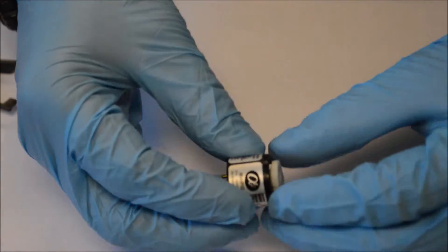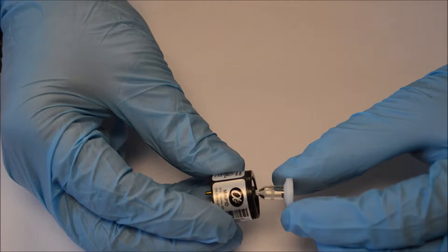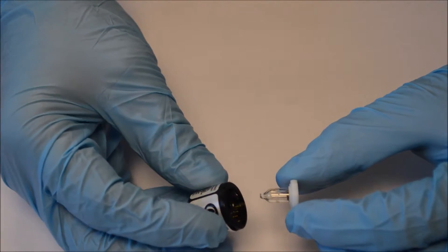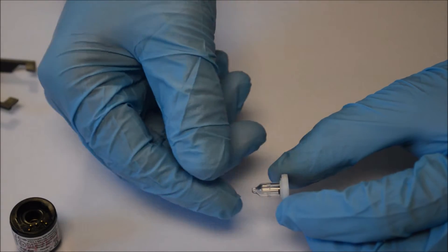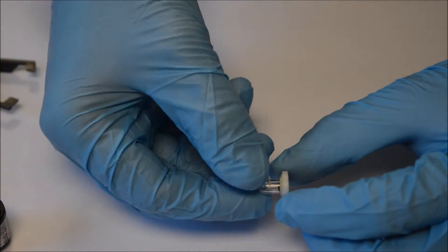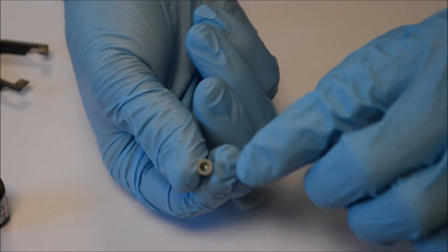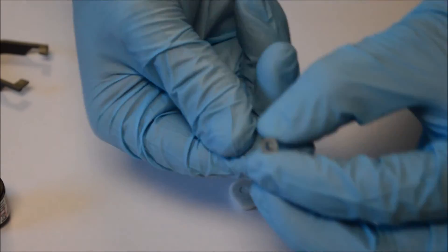From there we then will remove the electrode stack and the lamp. This little section is the lamp and what we need to do now is we need to clean the lamp window which is this surface which is what the contaminants can build up on.